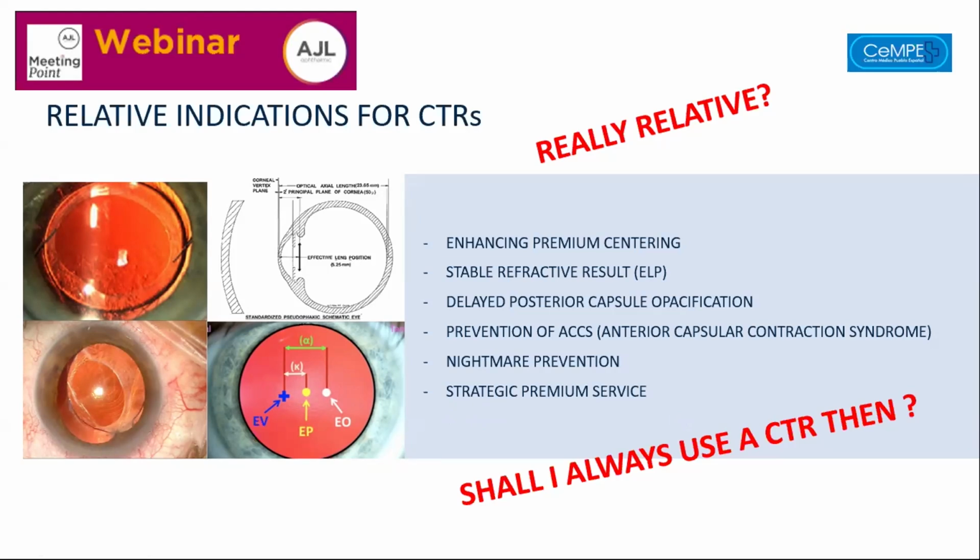You can find regularly in common cataract refractive surgeons between 1 and 3% of discomfort in the post-op because of inadaptation to the multifocality of the lens, halos or glare. So if the patient is really intolerant to the symptoms, you can also do an explantation and lens replacement even 1 year after surgery. So you need not hurry if the patient in the immediate post-op is not happy.